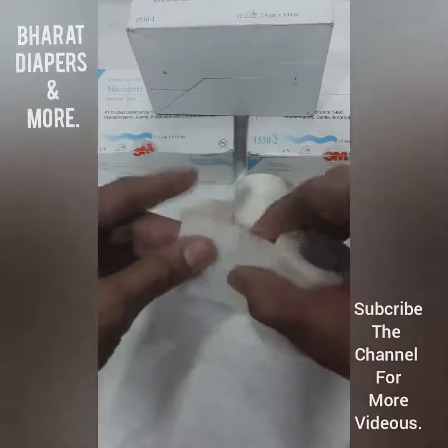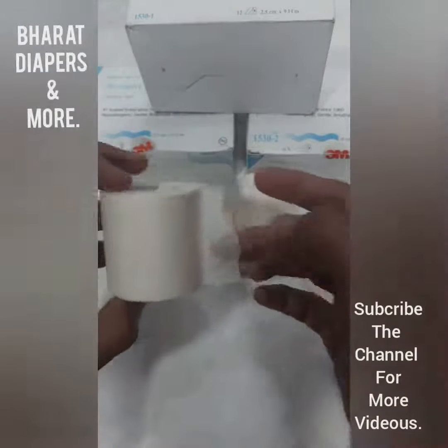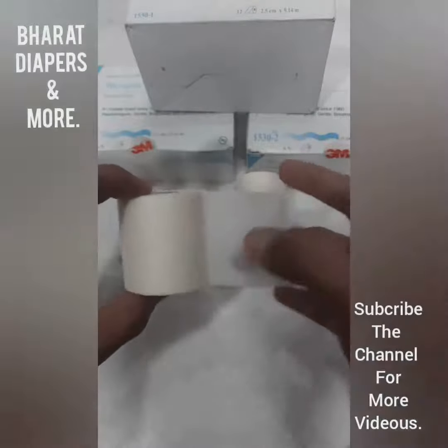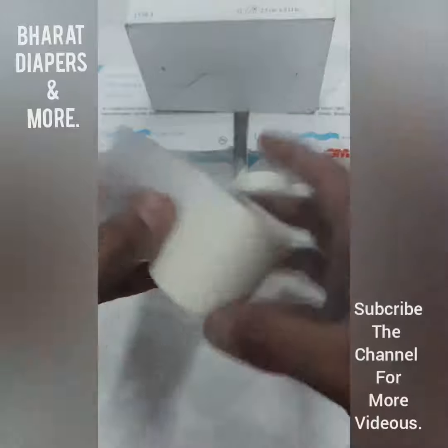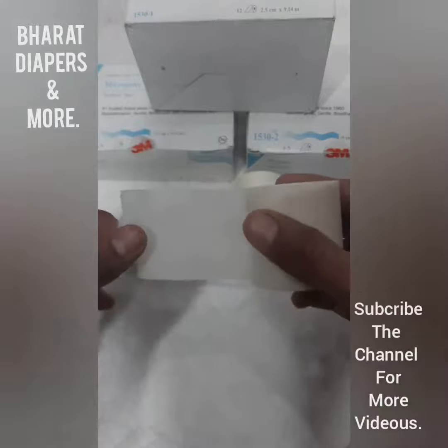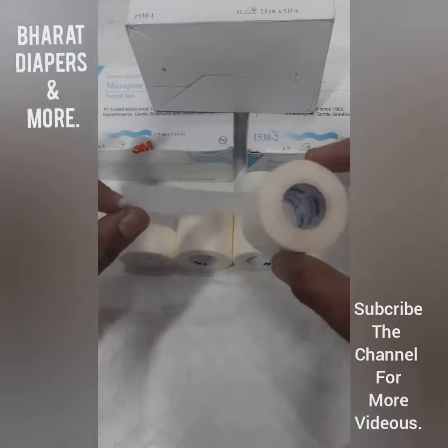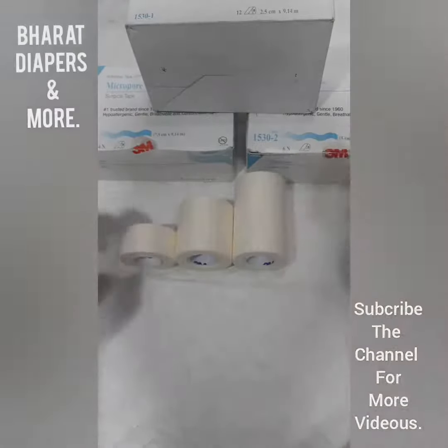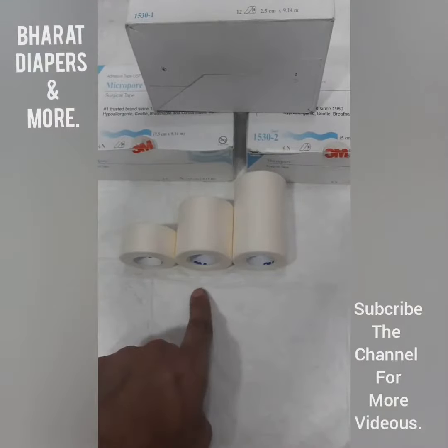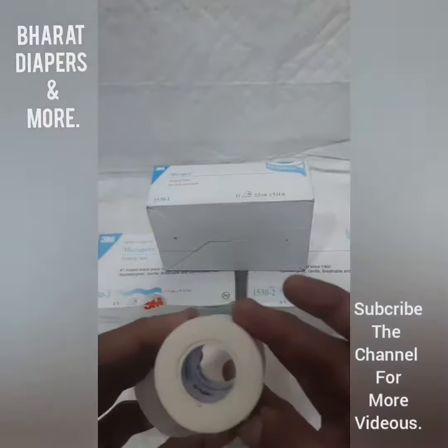Easily you can tear by your hand. Paper type, skin friendly, used for dressing. Micropore tape, 3M brand, good quality, sizes one inch, two inch, three inch, big quantity available.